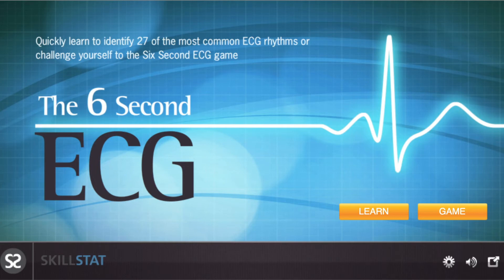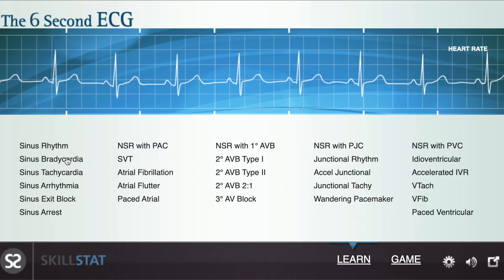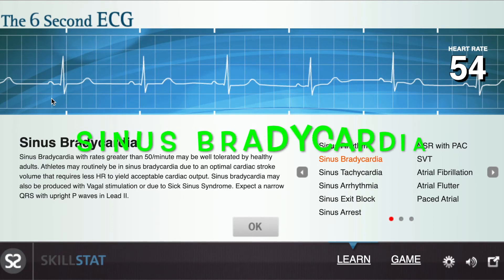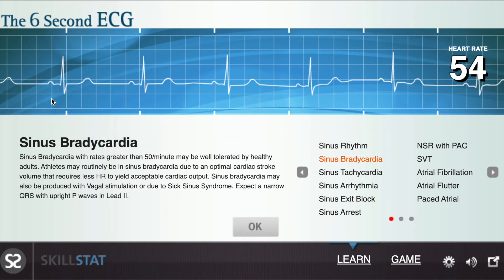Let's look at two different rhythms. When looking at this strip, I can count 5 QRS intervals. Therefore, the heart rate is about 50 beats per minute. This is an example of sinus bradycardia, as the heart rate is less than the normal range of 60 to 100 beats per minute.